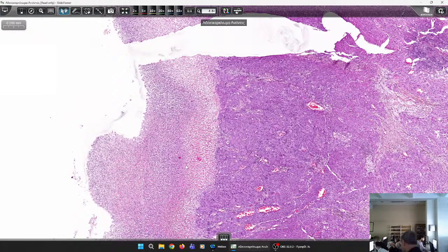That's why I told you, if you see ulceration in a mucosa, it could be inflammation, but it could be cancer. So take a good biopsy with viable tissue to see it under the microscope and tell the clinician if it is cancer or inflammation that causes the ulceration.